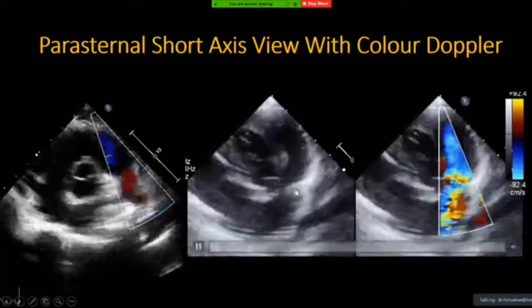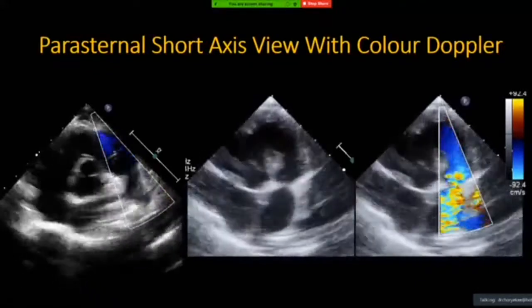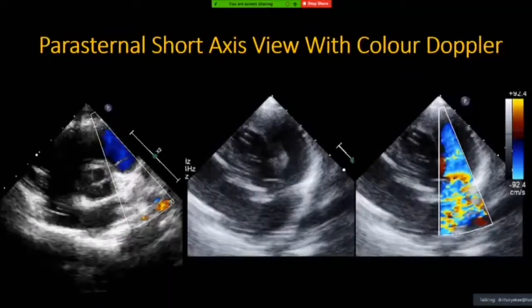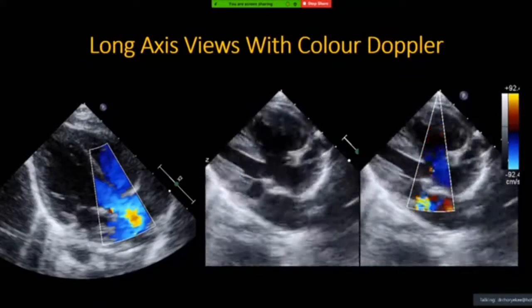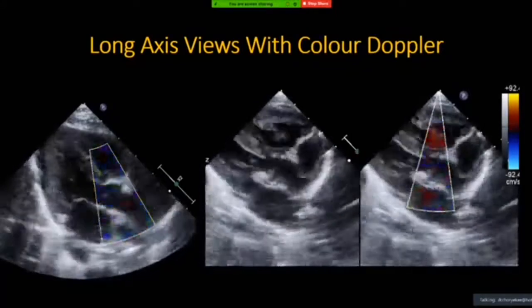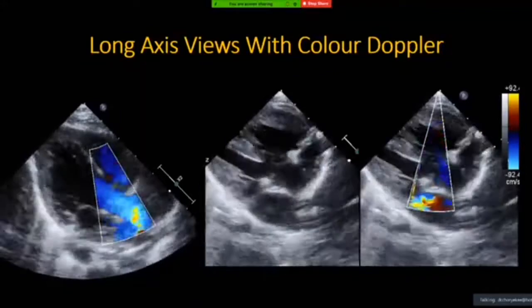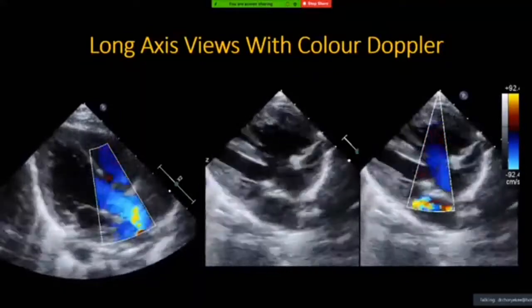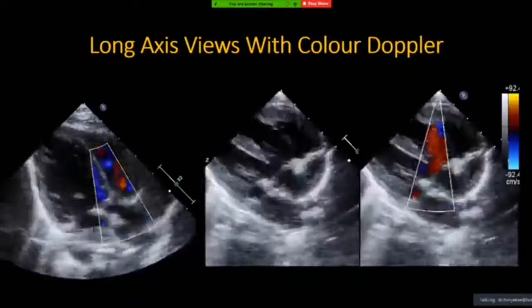The point I want to bring out here is that if you know what is normal, and you can compare normal to abnormal, our purpose as POCUS is not to diagnose the exact pathology. Our purpose is to say that yes, you have a child with low saturation but who otherwise looks well.